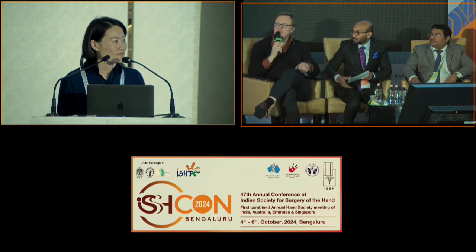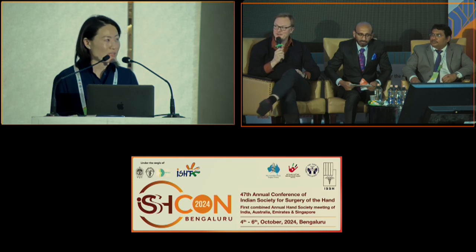Yeah. Thank you. But if you use a 4 millimeter screw, how is it like, a 4 millimeter drill hole that you do? Because I think that sometimes lunate can be problematic with the tunnel? It can be problematic.